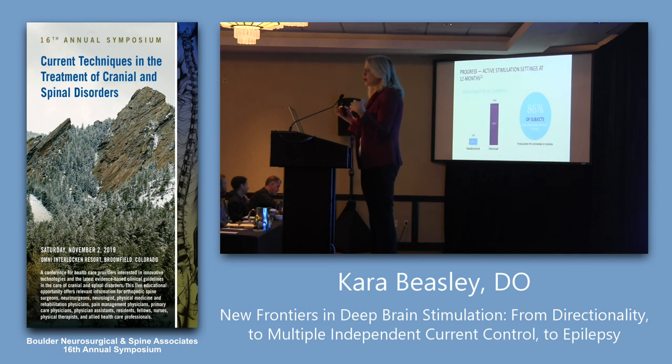So then you look at what are the active stimulations at 12 months? Remember, I said the first 6 months was either crossover, you either got omnidirectional or directional stimulation, but then the physician got to decide for the last 6 months. By the last 6 months, 86% of the subjects had directional settings. Their physicians, who were well-known, very skilled programmers, had decided that the best way to deliver energy and stimulation to get the best side effect profile and the best stimulation for these Parkinson's patients was with directional.